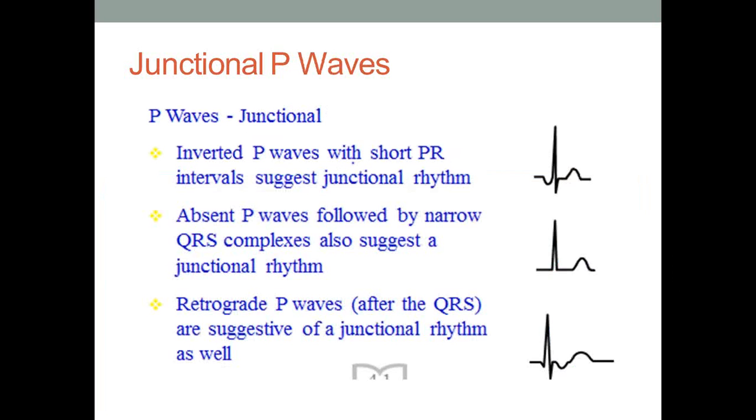So again, here is your inverted P wave. Here is an absent P wave, because you don't see it. And here is your retrograde P wave.